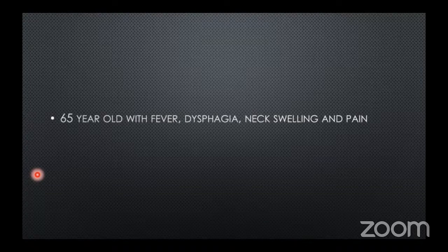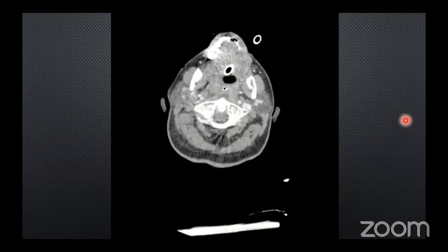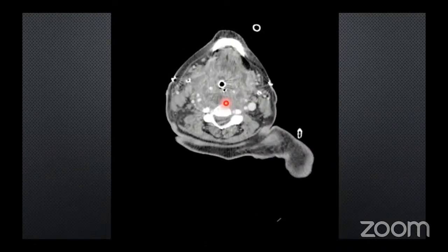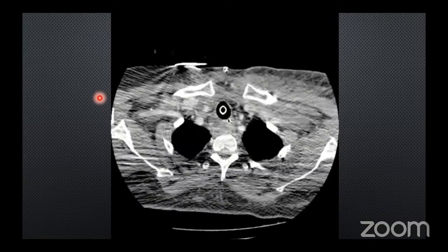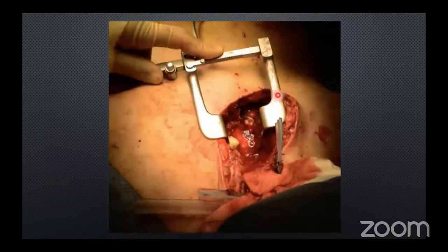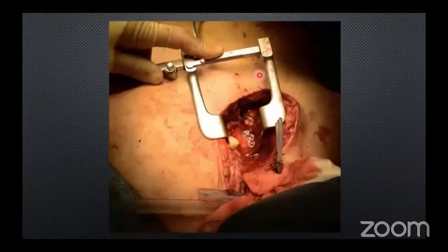So let's look at a 65-year-old with fever, dysphagia, swelling and pain. As you can see, this patient is intubated. There is a significant collection involving the parapharyngeal space and the submandibular space, going all the way down to the mediastinum, as you can see here. These are the situations where you should be thinking that you will not be able to drain this through the neck, despite having had attempts before. This patient required input from our cardiothoracic colleagues for drainage.